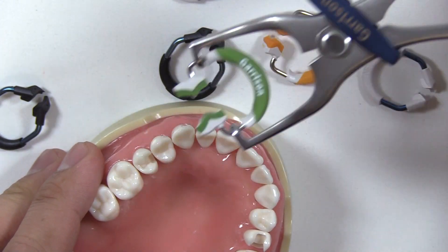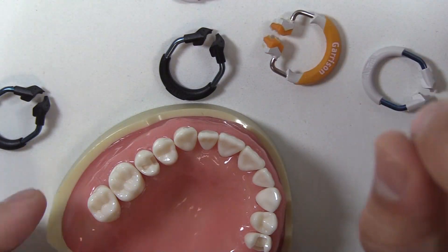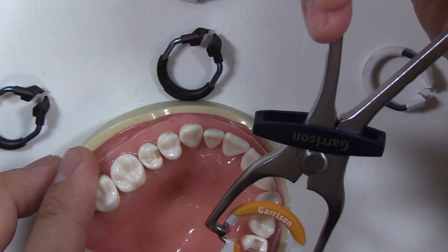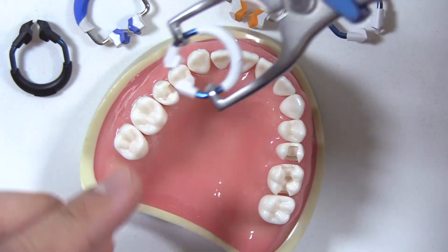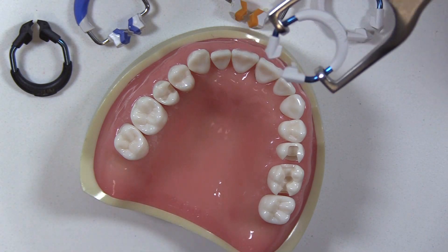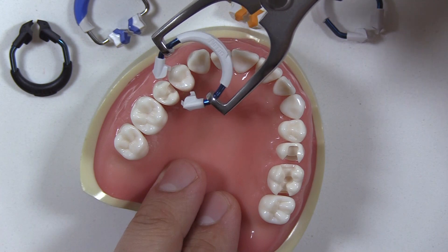It's important to do this before a matrix or a wedge is put in place. We've all had a matrix put in with a wedge, and then we go to put on our selected ring choice, and all of a sudden we crumple that matrix, or that wedge goes flying, or we break something. After I've prepped and I'm ready to fill, I've got my dam on — which is invisible at this point, but I promise you it's there — we can just try out the ring.